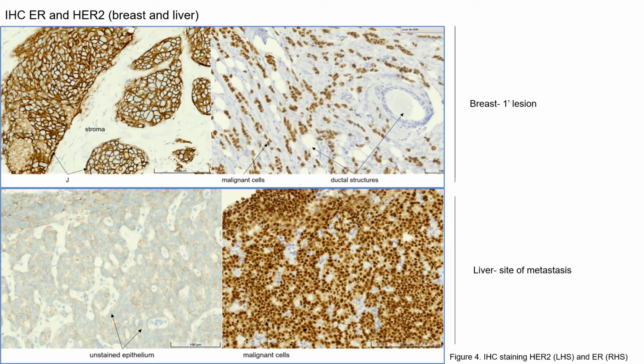Immunohistochemical staining with antibodies for estrogen receptor protein has stained units proliferating from inner epithelial cells, demonstrating presence of estrogen-positive malignancies outside of ducts in breast stroma. Similarly, HER2 stained positively, highlighting total membrane staining amongst infiltrative tumor nests.